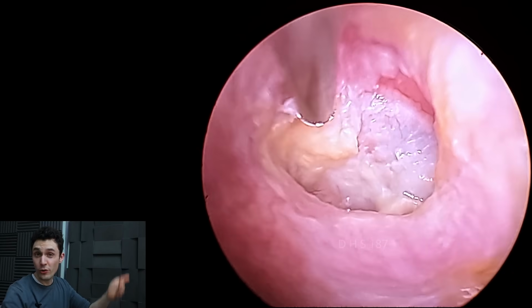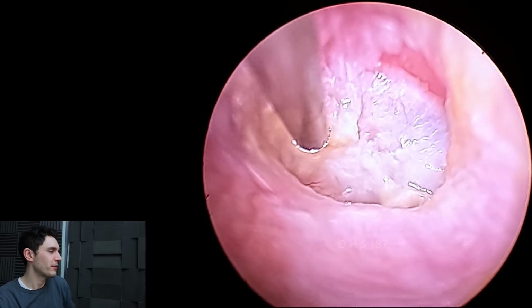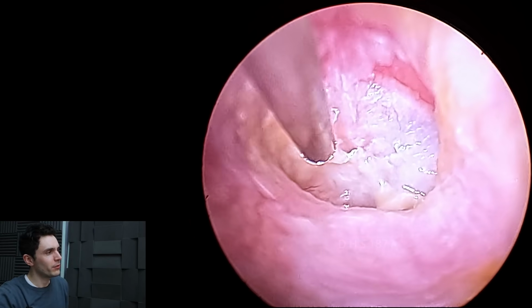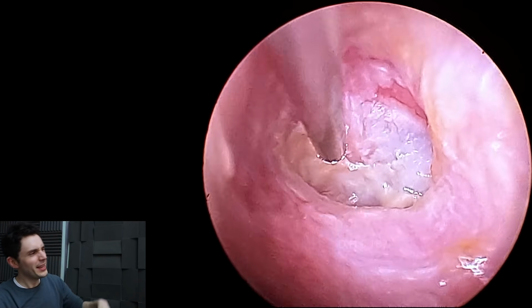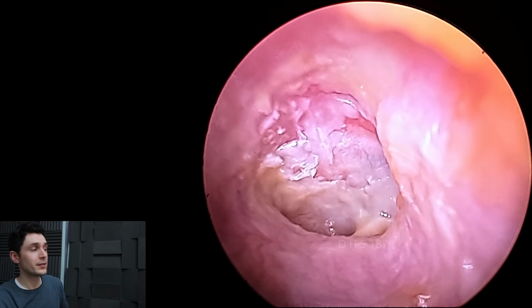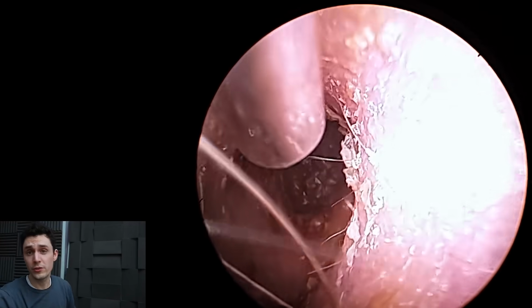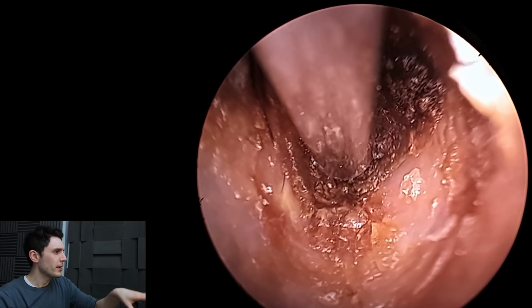It's kind of that bluish grey coloration. But again, patients had about as much as they can tolerate here. They're tolerant, but getting to this stage is getting a little bit uncomfortable. Hearing is considerably better. Still not perfect, but once we send them round to their general practitioner doctor, they'll get some treatment, and then we'll see them for a follow-up in 2 weeks, and it should be all back to normal. This is the other ear.